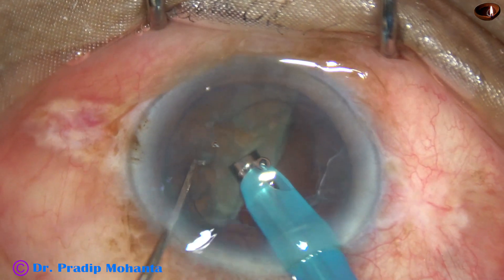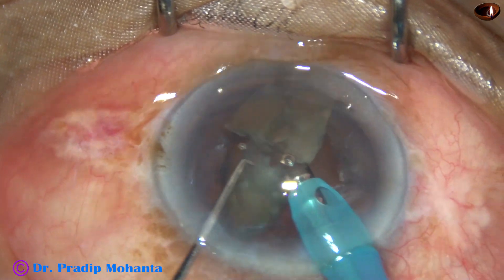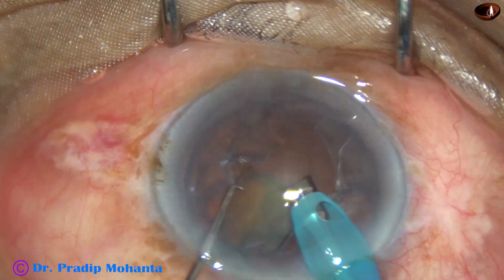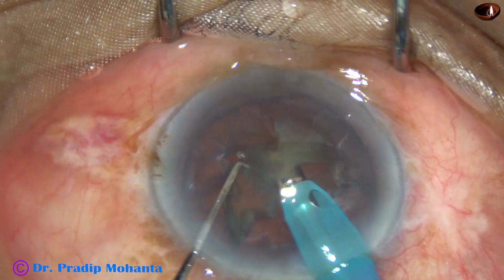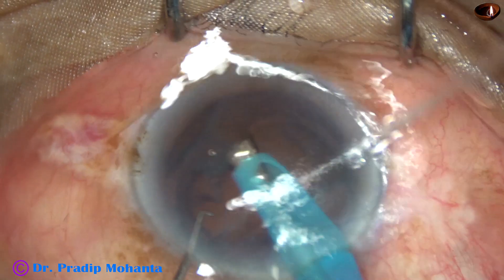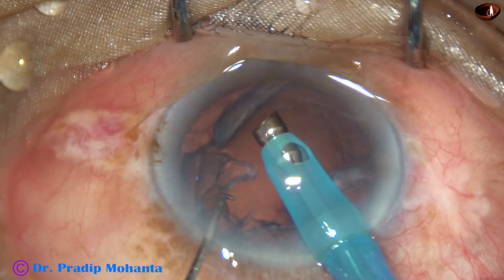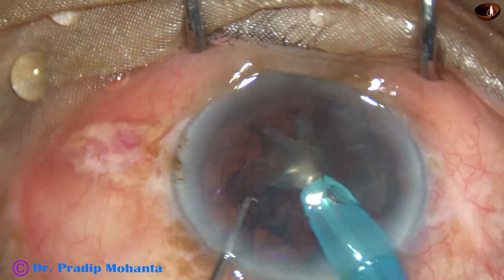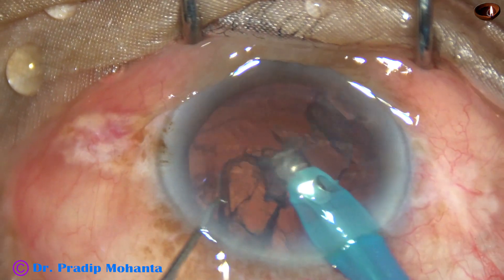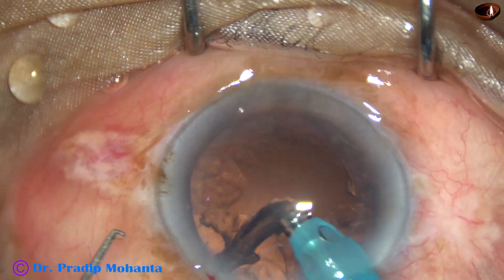In this case, just hold it, chop it, and emulsify into pieces. All these cases are real time and the nucleus management part is not at all edited. And now, after this case, we are going to see another case.